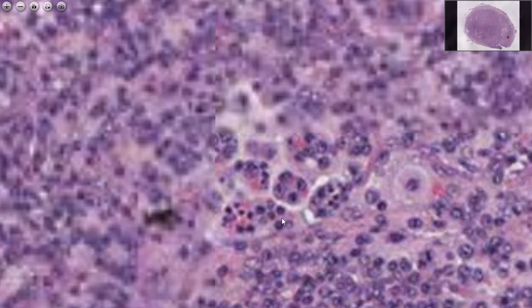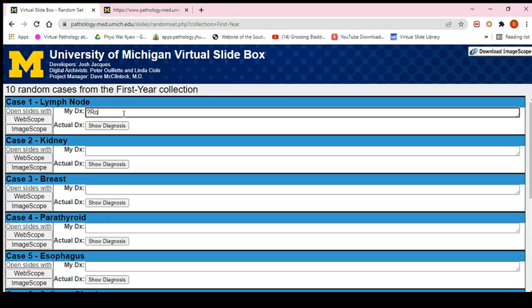So by this conclusion, I will check whether my answer is correct or not. Let's write my thought: query Rosai-Dorfman disease, and let's check out the diagnosis. Do you think I am correct, or not correct, or maybe at least I am correct in such a way that it's not malignant, and it should be reactive. At least I should be correct for that matter.